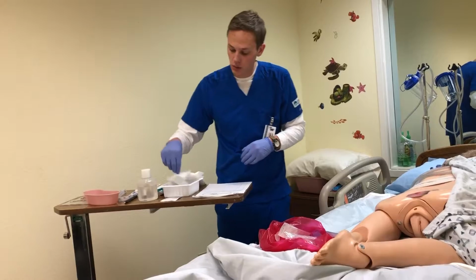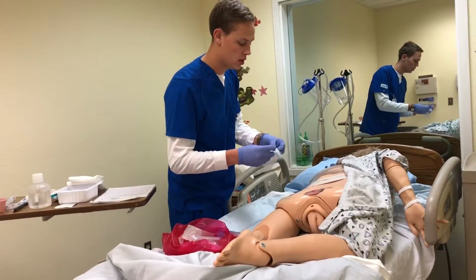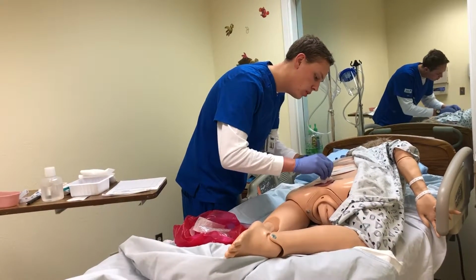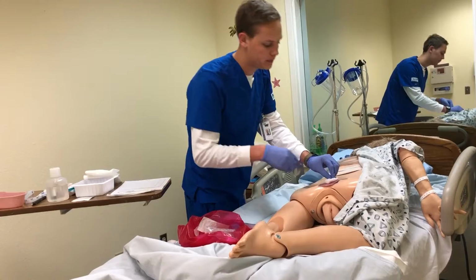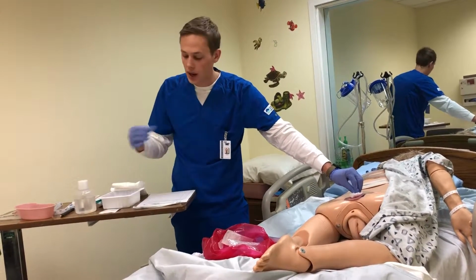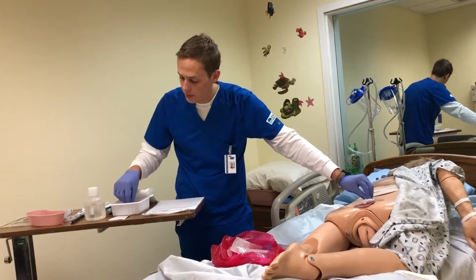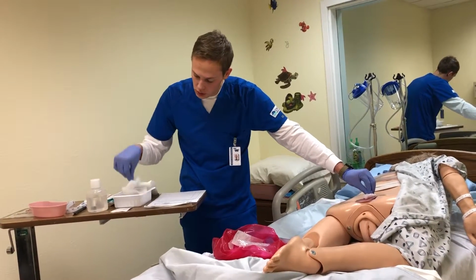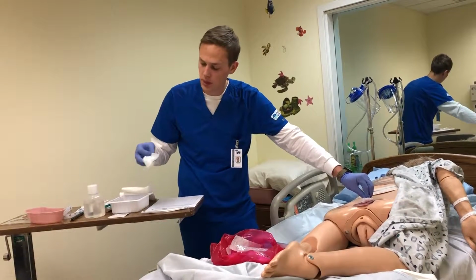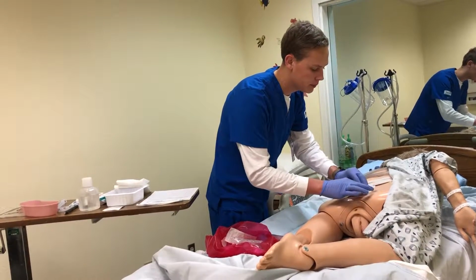and then with one, I'm just going to ball it up and place it right inside the pressure wound, not getting it outside onto the regular skin. Before I do that, I'd make sure to wring it out so it's just damp, it's not soaking wet. And then the same with this next one. I'd make sure to wring it out so it's just damp, not soaking wet. And then this one's just going to lay over top here.